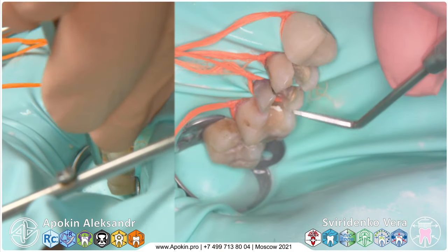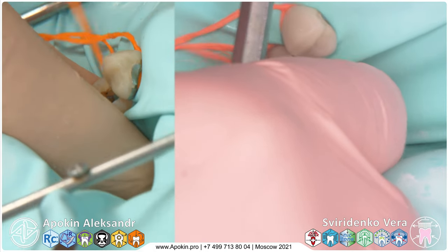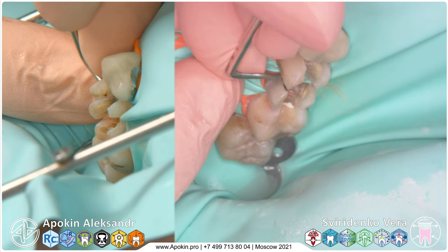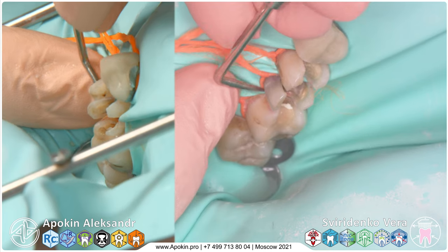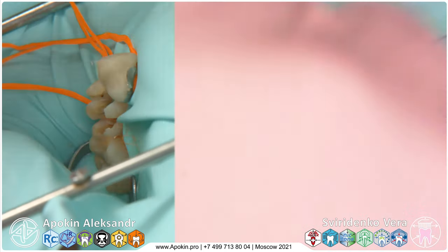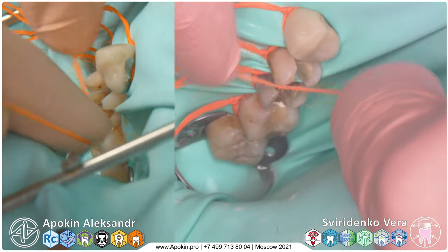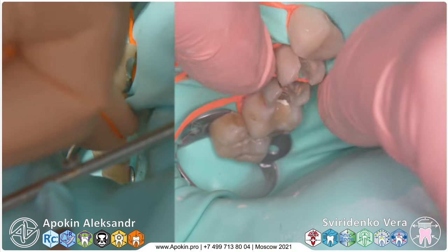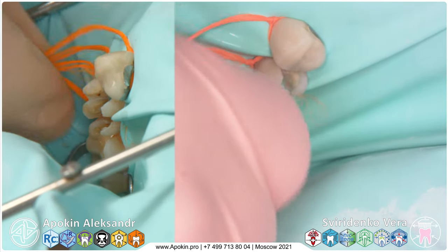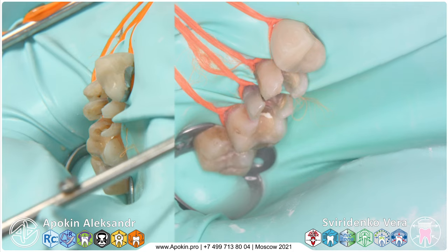We fix a new ligature. Insert it under the gingiva space in the whole perimeter of 2-15. And then check it with the close ligature. Collect all flosses, fix them very fast, and continue with the etching.